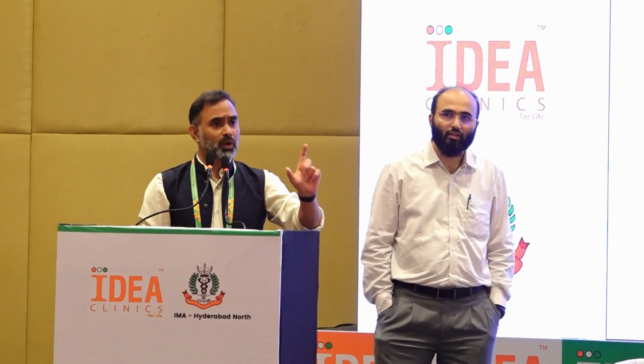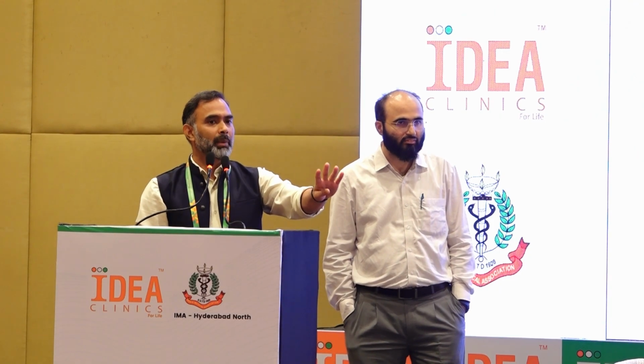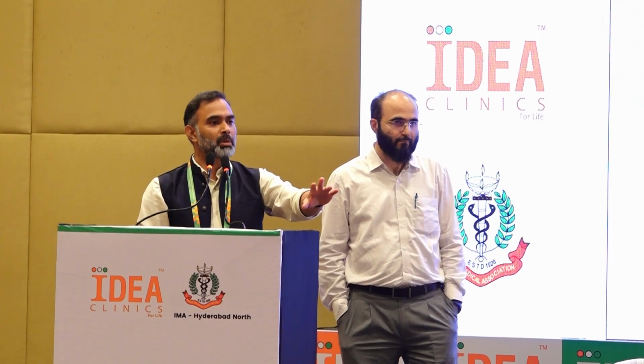Cost of blood glucose monitoring? The total cost is 6 lakhs initially. For the glucose monitoring, the sensor cost and the cannula cost will be 20,000 per month. Consumables, we call it. 24 hours glucose monitoring is 4,000 per week. It will be 4 weeks, so 16,000 plus consumables around 4,000. So 20,000 per month is their expense, apart from insulin. They will not require basal insulin. It's only short acting, only bolus we use.